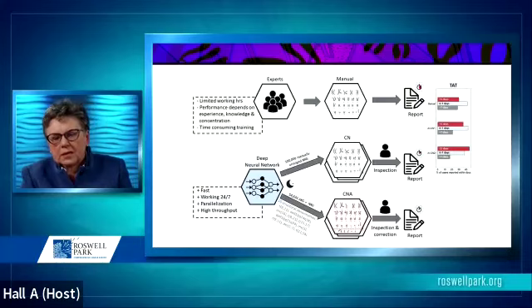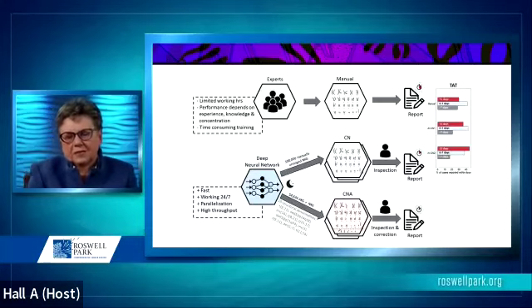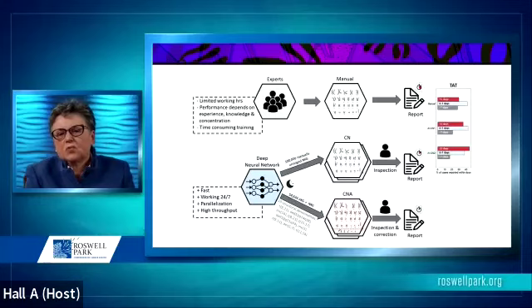This was reported as an abstract at the American Society of Hematology meeting in 2020. They used 100,000 manually placed karyotypes as a training set. They then used another 500 sets to see if they could reproduce the same analysis.